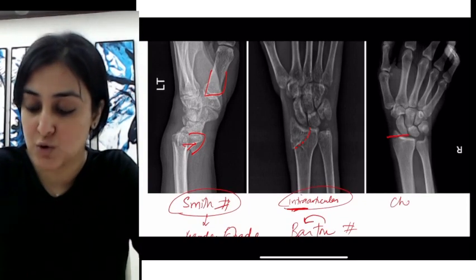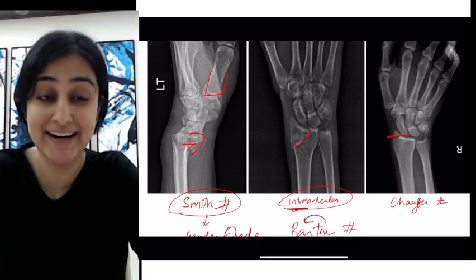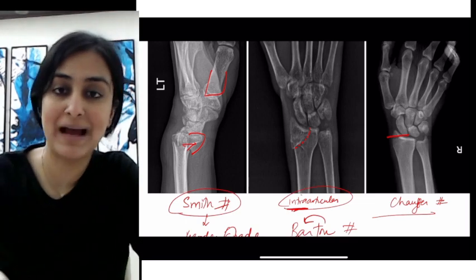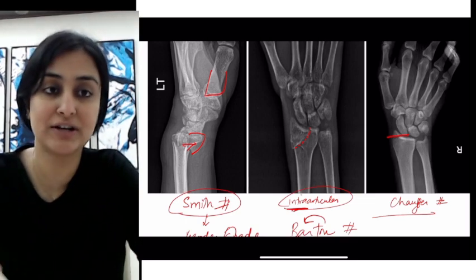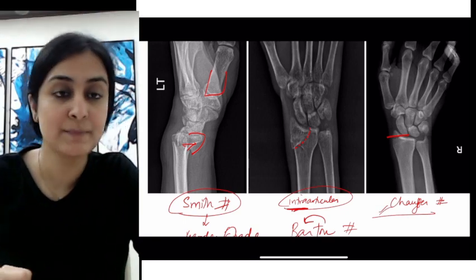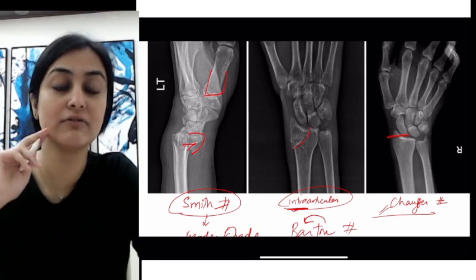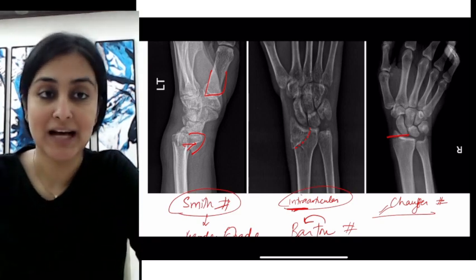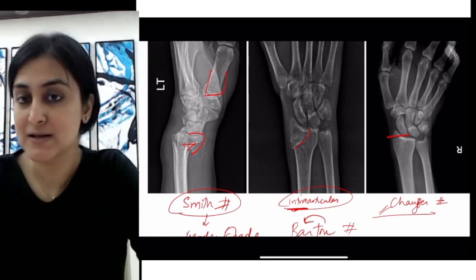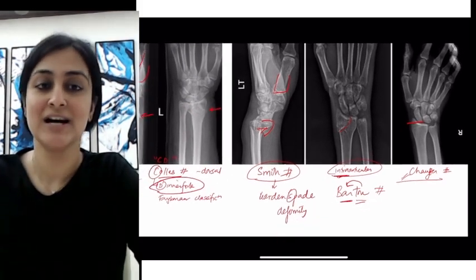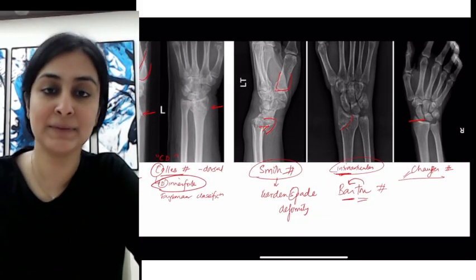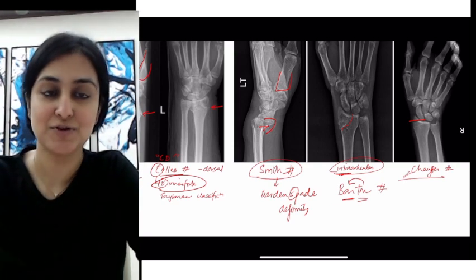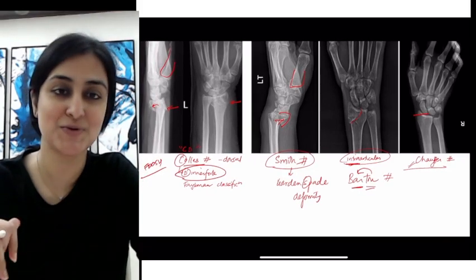Finally, when only the radial styloid is fractured, this is called the chauffeur fracture. In the old days when you had to crank-start a car with a stick, impaction would cause the radial styloid to fracture like this. The structure that attaches to the radial styloid is the brachioradialis muscle, which gets avulsed. So to summarize: Colles', Smith's, Barton, and chauffeur fracture are the four distal radius fractures we discussed today. Thank you, I hope this was useful.